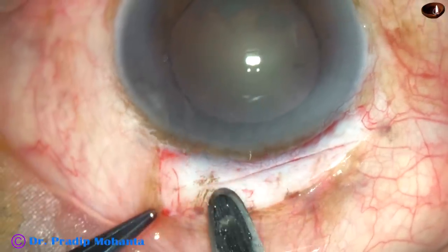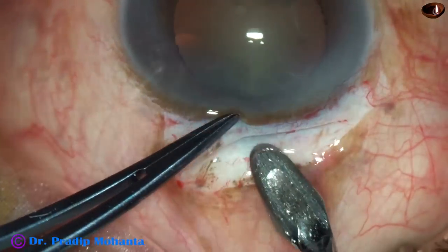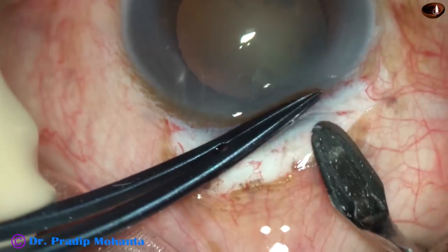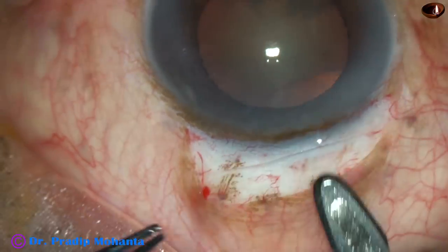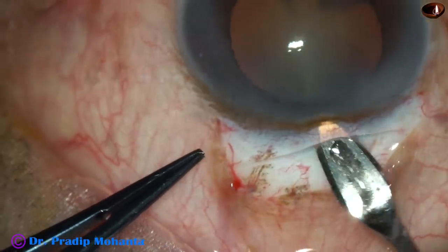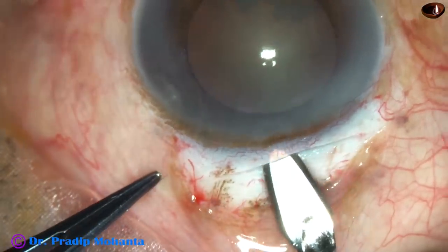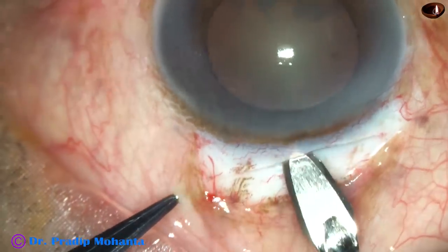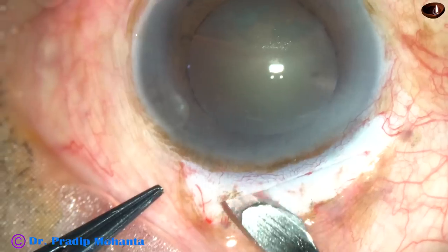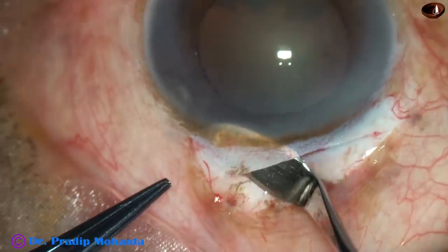This incision is about 7.5 mm. First, superficially, then use the crescent blade to go to a deeper plane. Once you are almost half thickness deep, go forward and then sweep backward in this way. You can make a very good tunnel — half of the tunnel on the left side is now made.